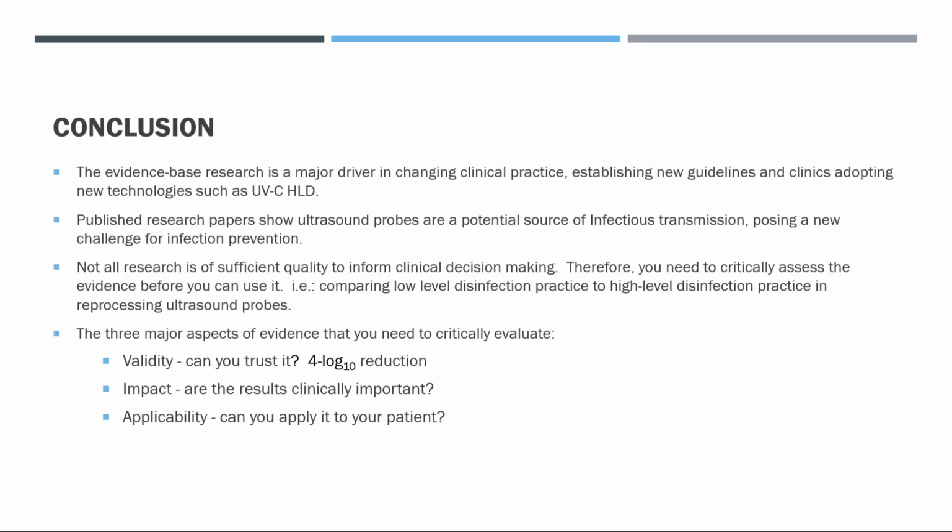So in conclusion, evidence-based research is a major driver in changing clinical practice, establishing new guidelines, and clinics adopting new technologies such as UVC high-level disinfection. Published research papers show ultrasound probes are a potential source of infectious transmission, posing a new challenge for infection prevention. Not all research is of sufficient quality to inform clinical decision-making. Therefore, you need to critically assess the evidence before you use it, not only for ultrasound probes, but for everything you do in medicine.